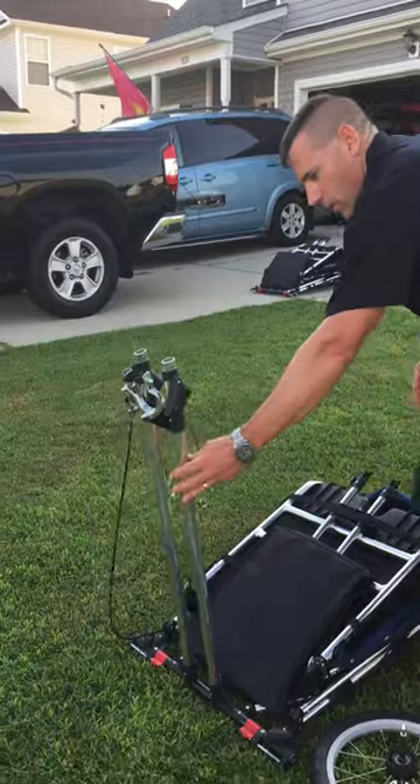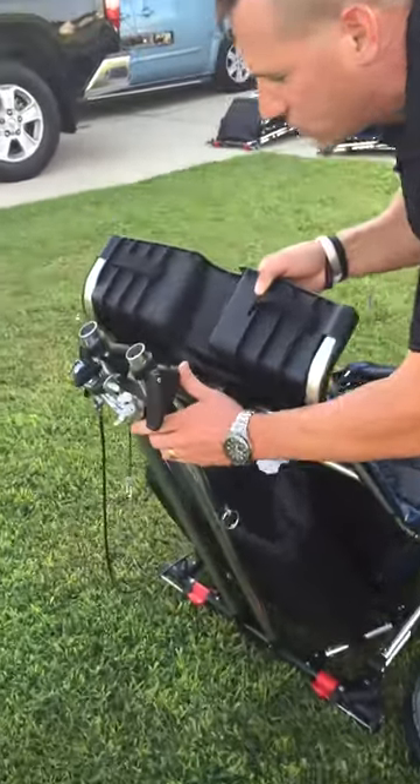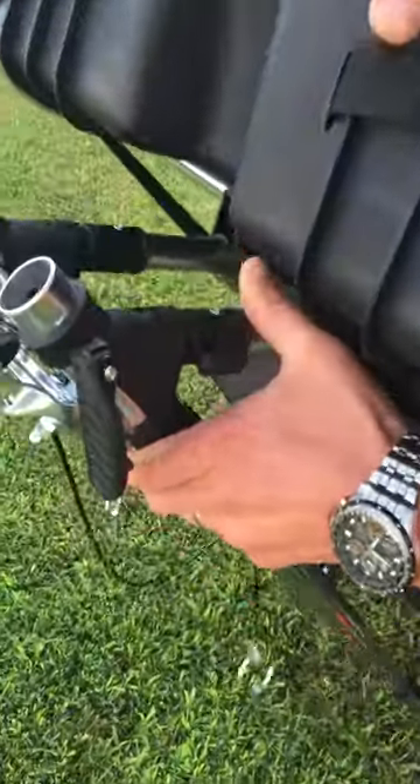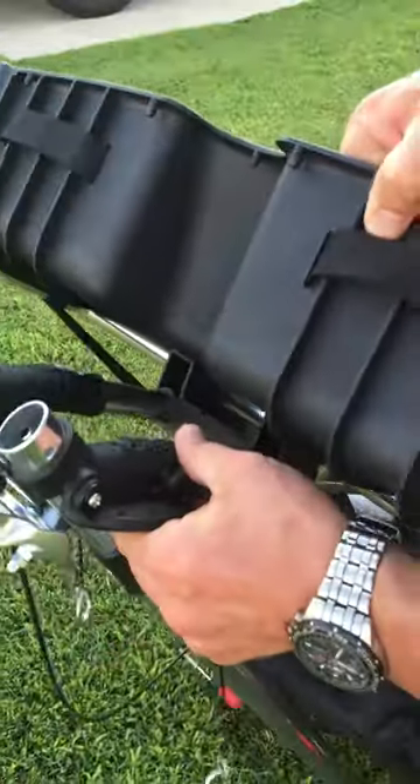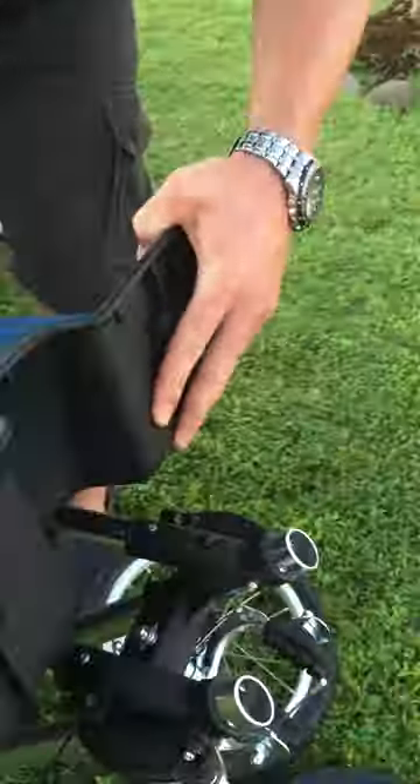The first thing you want to do is take this particular frame piece — you're going to fold it out, take the actual body, and you're going to put it into the fork. You press this button, and it'll go right in. Then we're going to secure it with these two plastic pieces. At this point, we've got the frame secured.